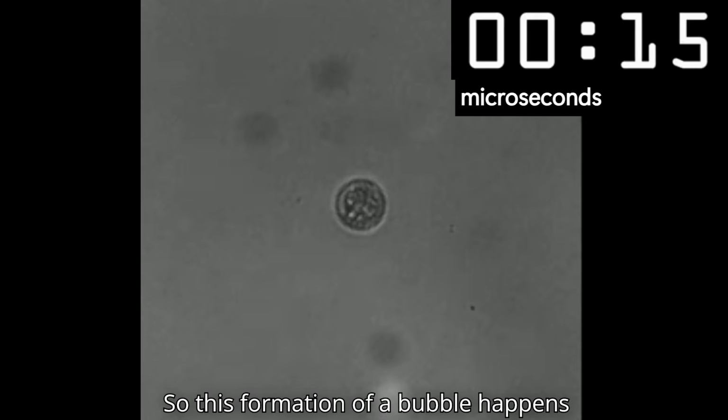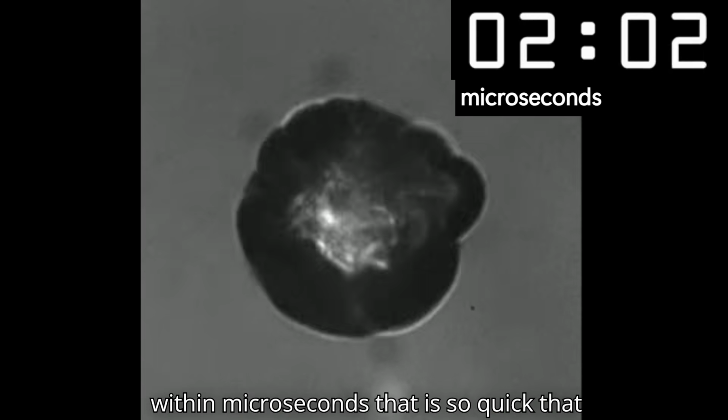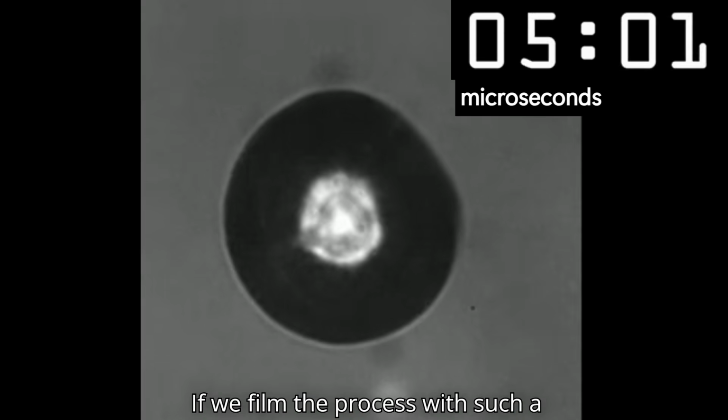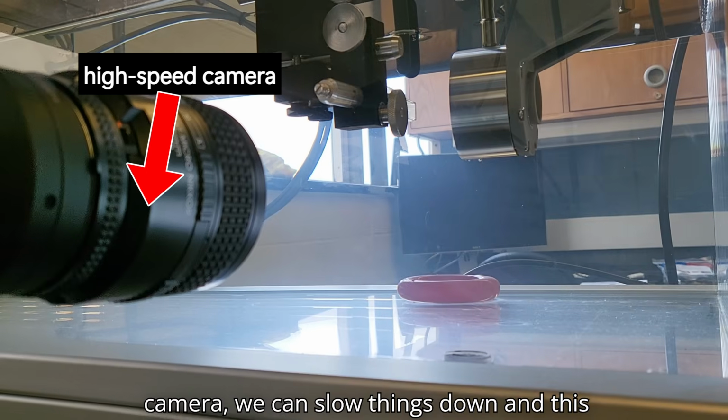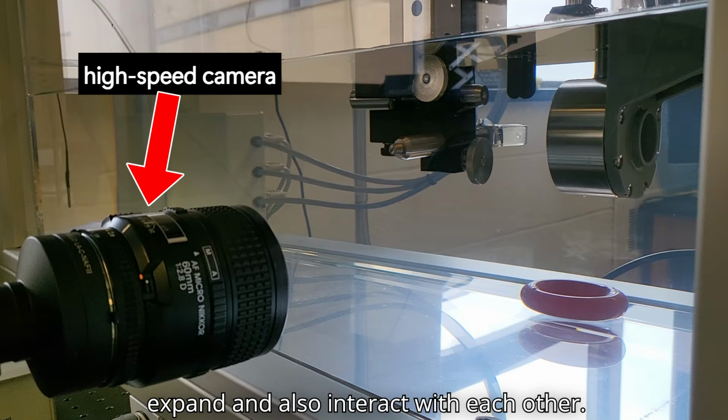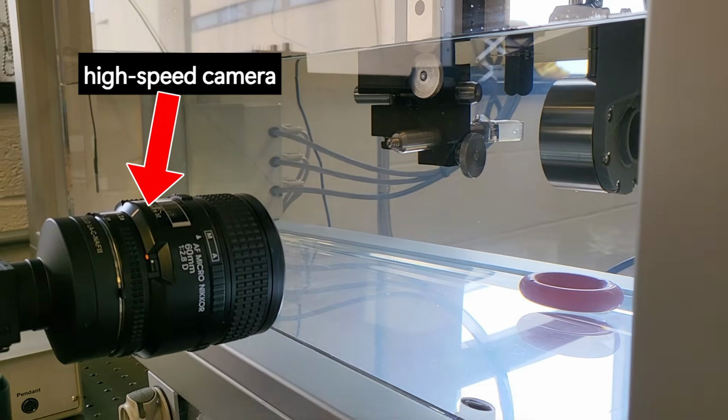So this formation of a bubble happens within microseconds. That is so quick that we need a high-speed camera to see what's happening. If we film the process with such a camera, we can slow things down, and this enables us to watch the bubbles form, expand, and also interact with each other.